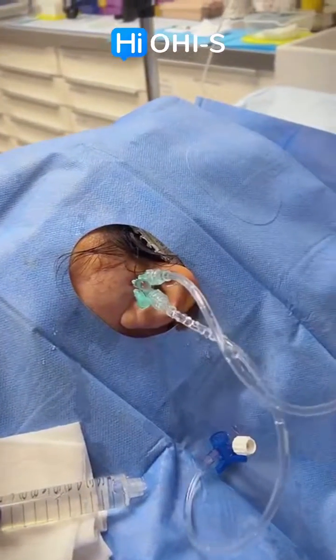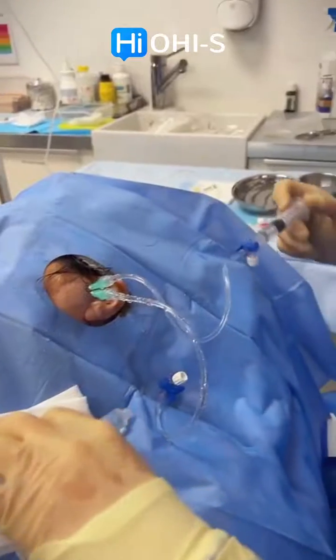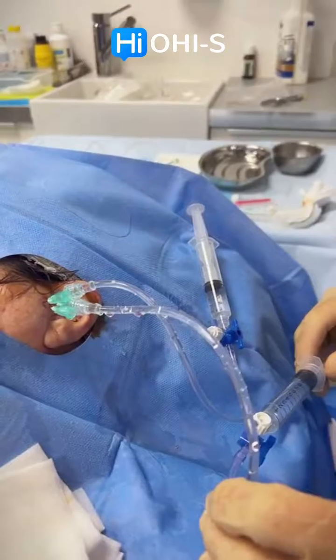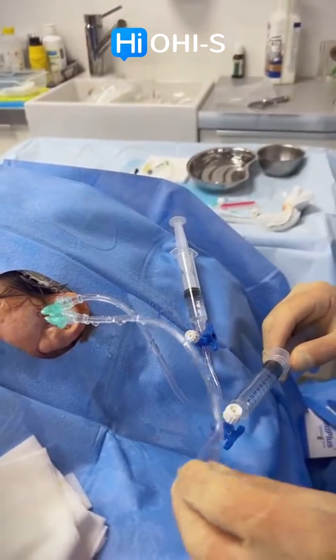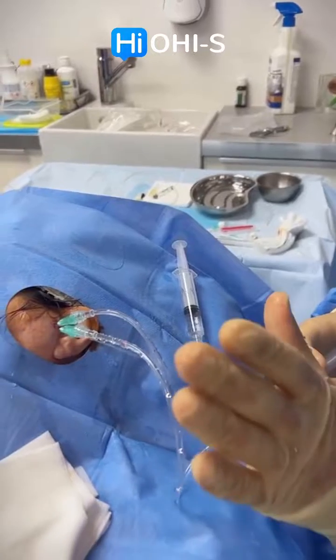Let's show the upper compartment washing. And here I will connect now to the lower compartment — like this we can wash both compartments. You can see the lower compartment here.